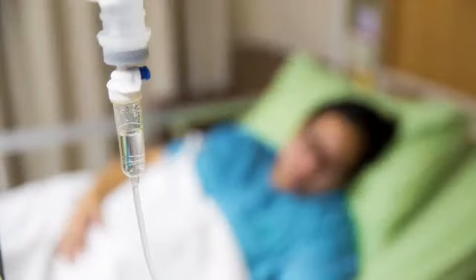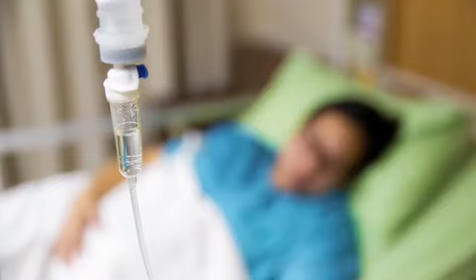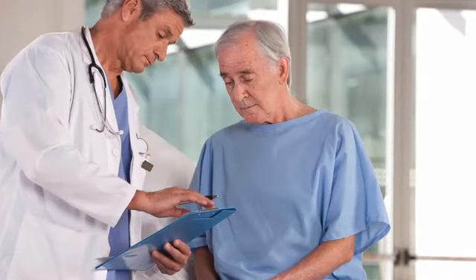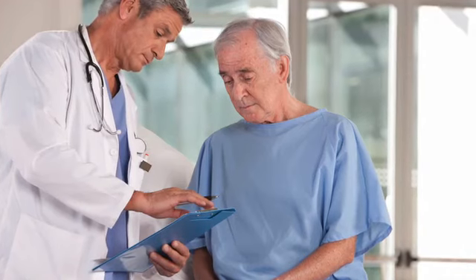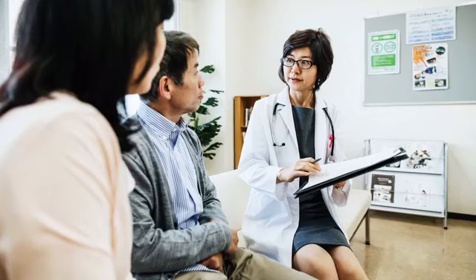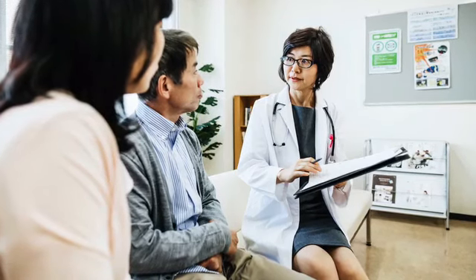You may also receive some type of sedation or anesthesia to help you relax or block the awareness of pain. If you are going to be going home after a procedure, you will likely need a ride home, as you may be groggy or cloudy from medications that are given either during the procedure or following the procedure. As part of your preparations, ask about your ability to drive yourself home, because with some procedures, you can go back to your normal activities, such as driving, immediately.